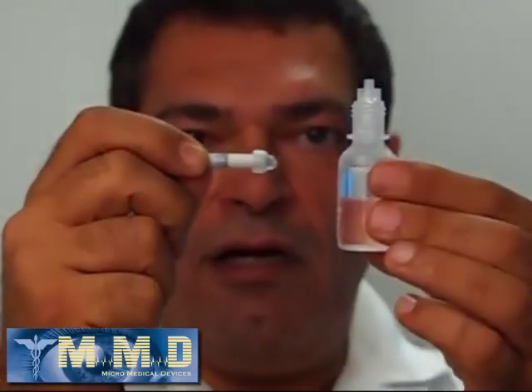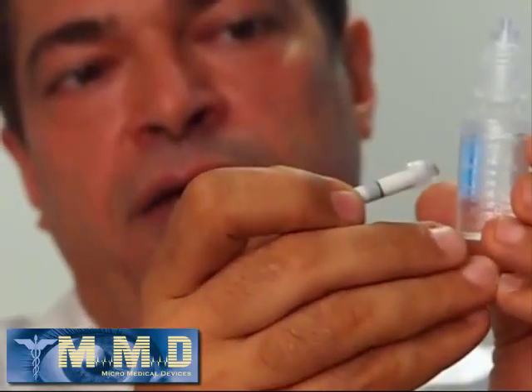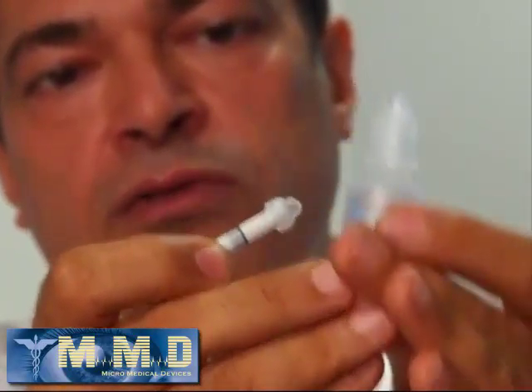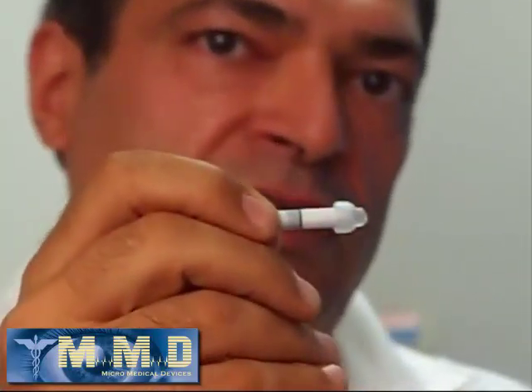You want to make sure that when you approach the cornea, you approach it straight on. The patient does not have to be tilted back with this scanning apparatus. You don't want to press too hard or approach at an angle that drains the meniscus completely. If you touch the eye at an oblique angle instead of perpendicular, you create an avenue for the water to escape. Approach the eye straight, and once the tip touches the eye, do not force into the eye.